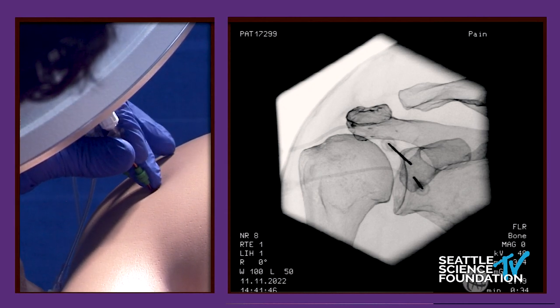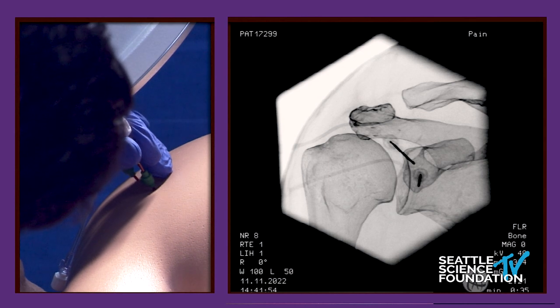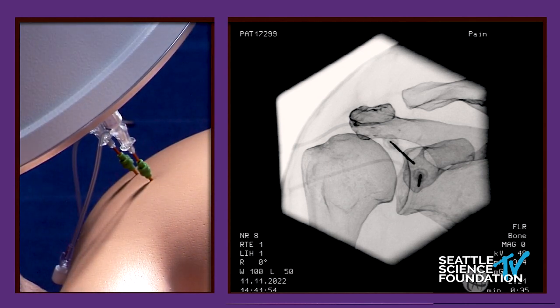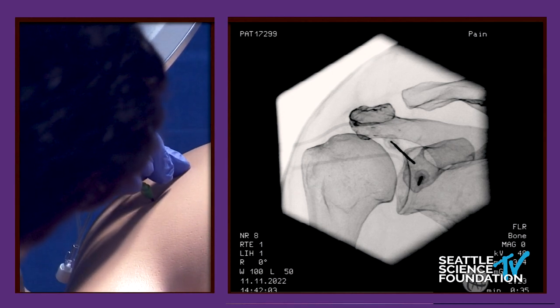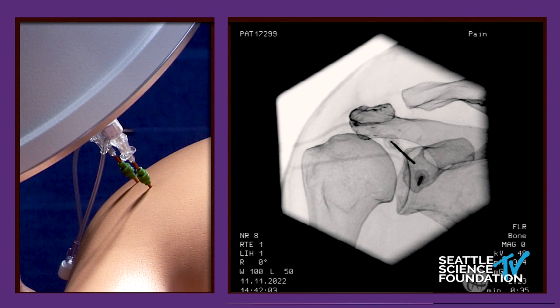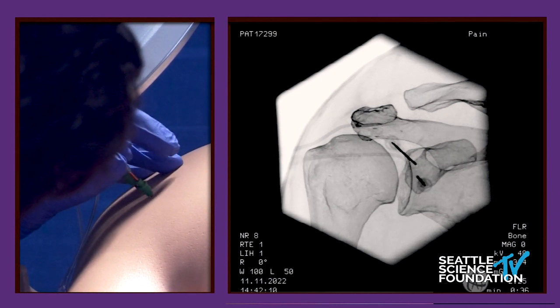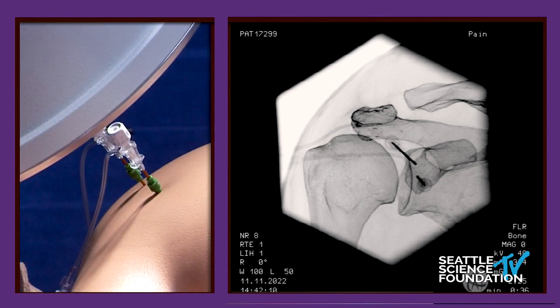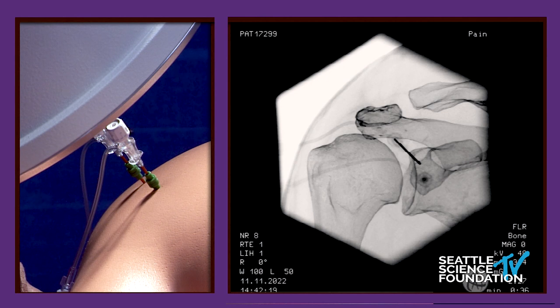If you imagine the two circles side by side with the other one — are you on bone there? So I would just go a little bit more superior, and then just touch down to bone. And a little bit more medial. That's nice. That's perfect. So that's exactly what the lesion's going to look like. If you take that circle, put it on the superior needle's tip, you can see that's where the lesion would be.